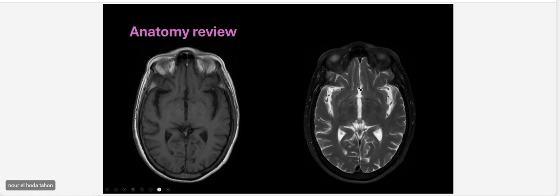And again, we have here this cut with flow void vessels, and this is the place for the ACA, the anterior cerebral artery, and we have here this part of the ventricles. Anyone know what this is? Third ventricle. Yeah, excellent. You are awesome, guys. You know it very well.